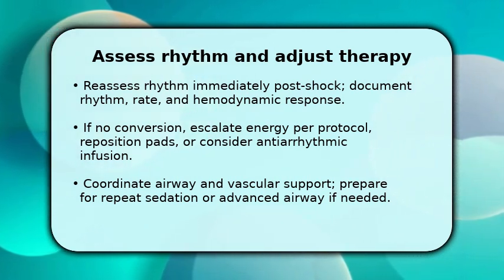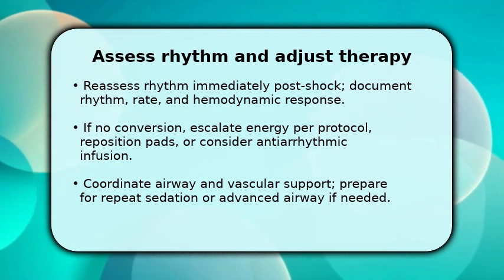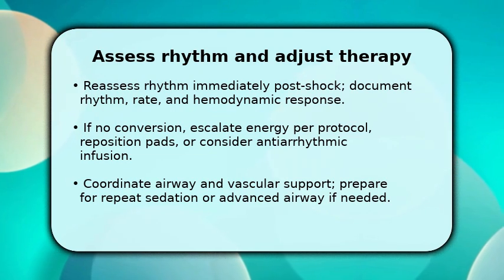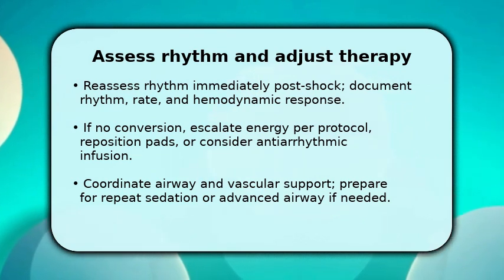Make sure sync remains on to avoid R-on-T. Meanwhile, consider an IV bolus of amiodarone or procainamide per guidelines and continue hemodynamic support. Communicate with your team about timing, sedation needs, and readiness for immediate repeat shocks or alternative interventions.